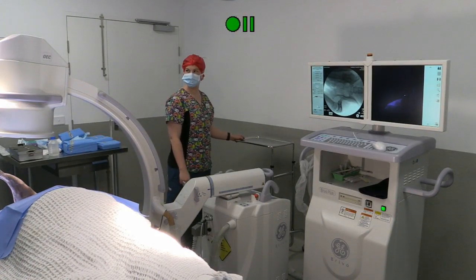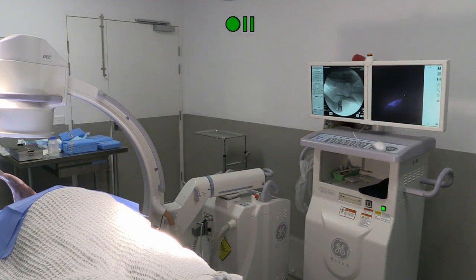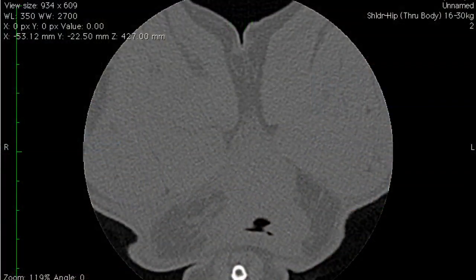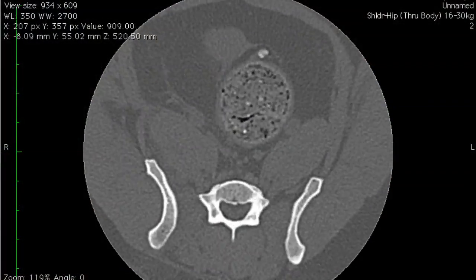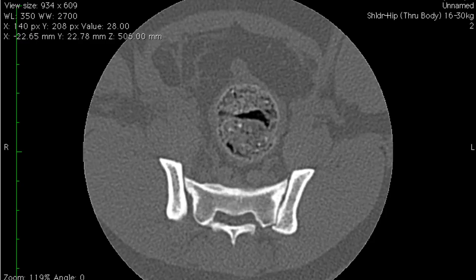And just before we do that, Charles, just show them, I'll just measure how long I want this screw to be. Yep, so James has just asked me to measure how long the screw needs to be, and so I'm going to do that back on the CT scan. So we'll go to the other SI joint, and I'll get a ruler here. You want to go halfway across? I'm at 32 mil, so just to the opposite side of the canal. Like that? All right, so what I'm measuring here is 30 millimeters-ish. So 32 will get you to the opposite side, and that's including the thickness of the ilial wing.